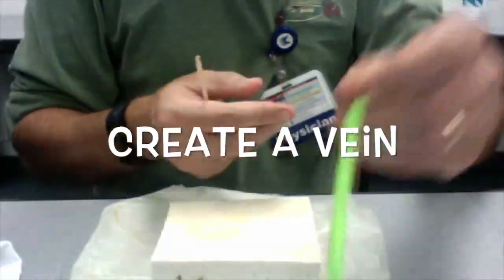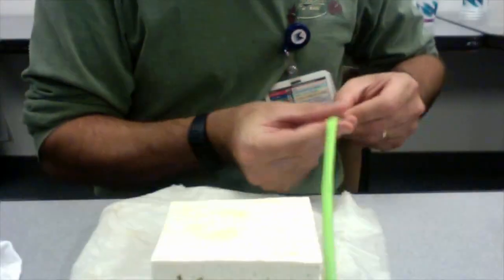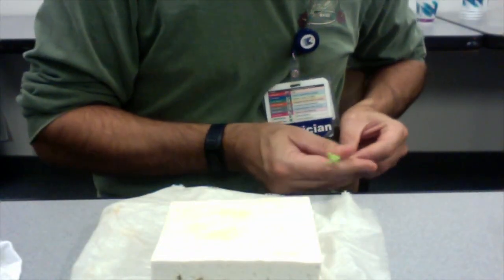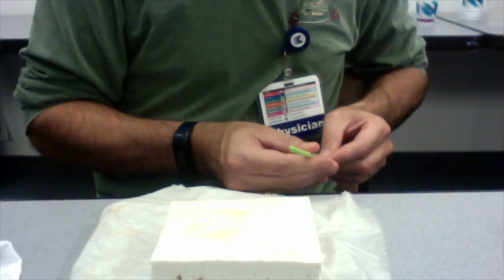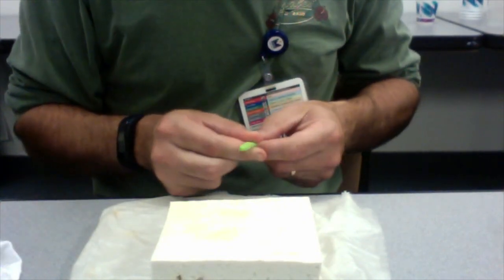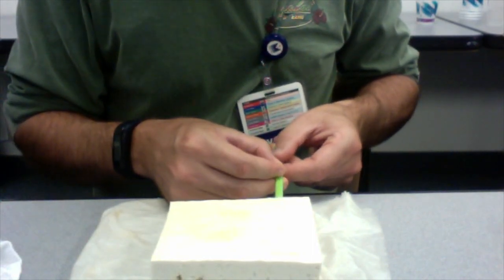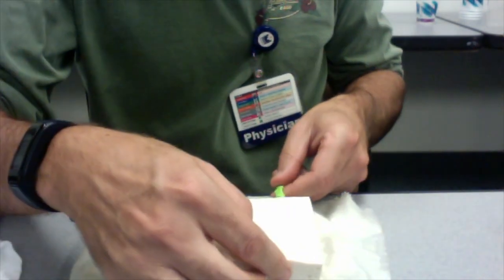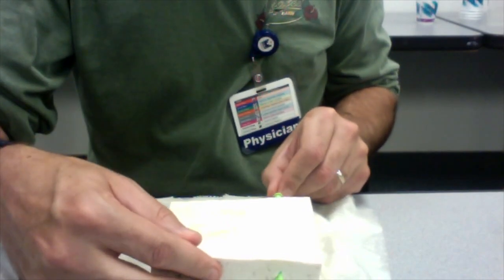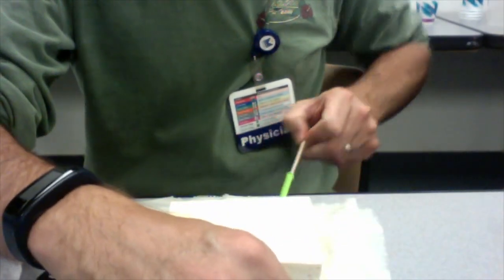So this is to create a vein that you can practice putting central lines in. Just take the balloon and feed it over the stick, bring the balloon completely to the end of the stick, and just gently pass it through the tofu at the depth that you want it for your procedure. When it reaches the other end, you can grab onto the balloon and then pull the stick out from the other side.